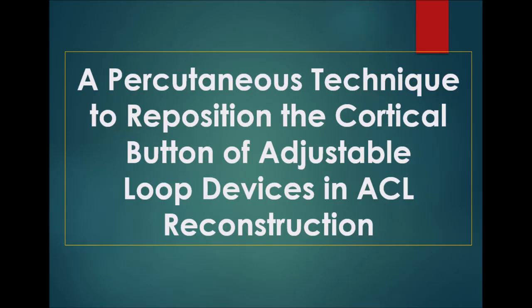We describe a percutaneous technique to reposition the cortical button of adjustable loop devices in ACL reconstruction. This technique uses the standard arthroscope sheath for a 4.5 mm 30-degree arthroscope.